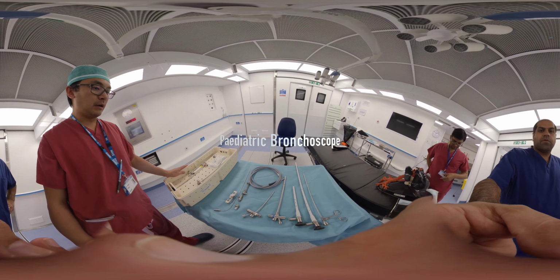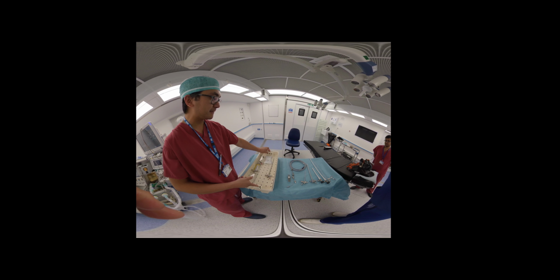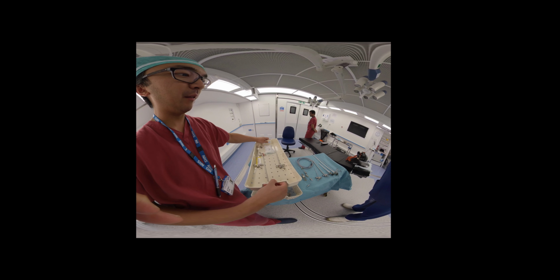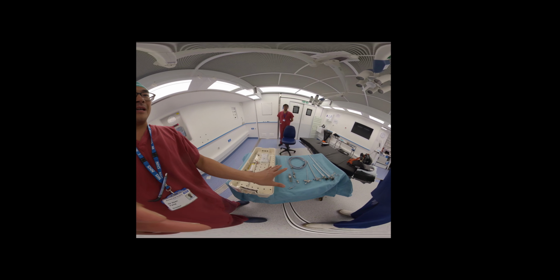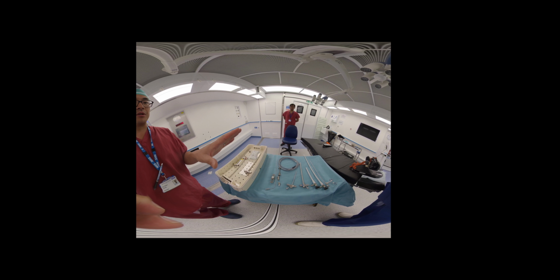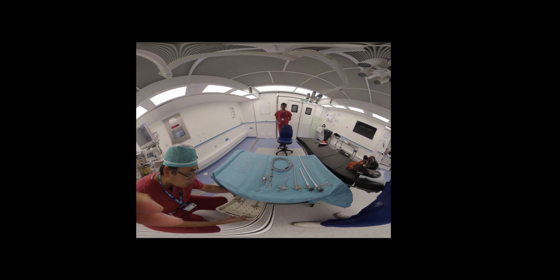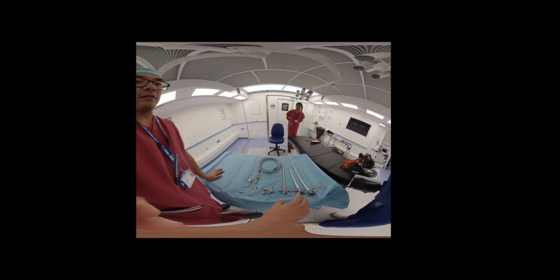Great. Okay, Sean's going to talk us through the paediatric bronchoscope. It usually comes in a set like this, and you'll have lots of different bits and pieces, with 2 levels to it, with the grasping instruments below, and then the scopes and the endoscope on the top. These are basically all the equipment that you'll need, and we'll show you using this how to assemble and how to use the bronchoscope. So the first thing to get is roughly the size.